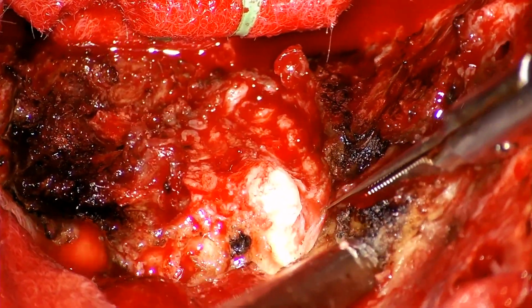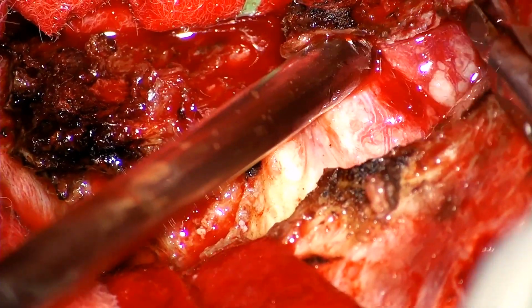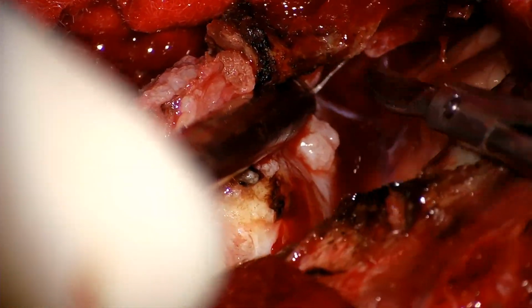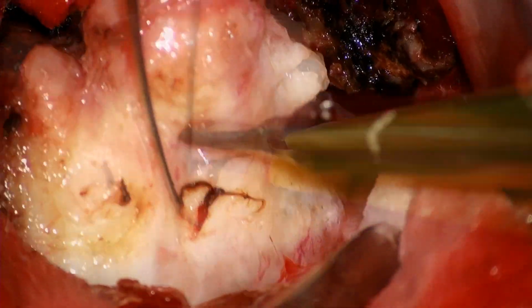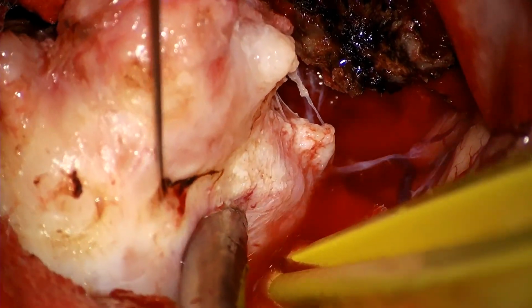Then we just need to work our way through the frontal dura and connect with the temporal cut to fully untether the tumor from its dural margin. Now we just need to complete the critical step: to dissect the tumor off the deep arachnoid plane. Here in sphenoid wing meningiomas, it's extremely important to preserve the deep venous system.